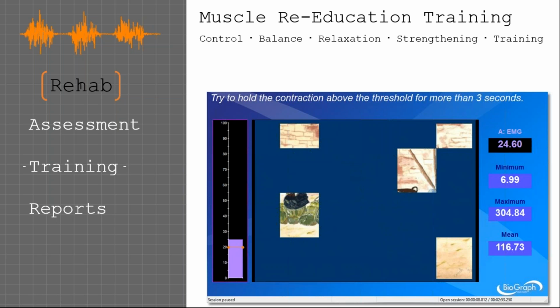One thing you'll hear from Thought Technology all the time is everything's customizable. What's that mean? We can change what this time period is if we need to. We can change the metrics that we're displaying. We can change the graphics that are being displayed. You could bring in your own graphics. You could bring in your own music. You can attach to a DVD instrument, so a video plays. Again, engagement for the client is really going to be maximized.